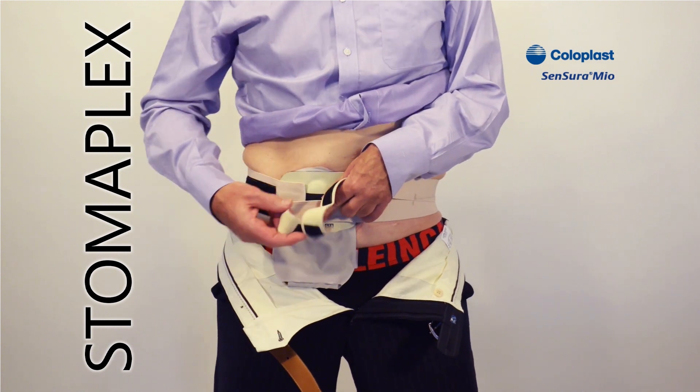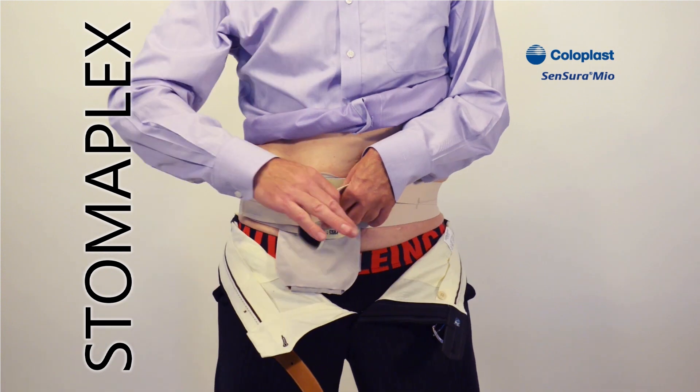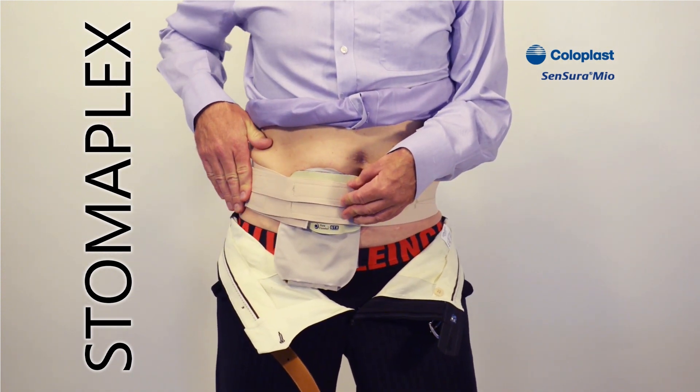Bring the two straps around. They get fastened independently with Velcro to the Velcro pad on the outside. You can bring the other one around and attach it like that — nice and easy.